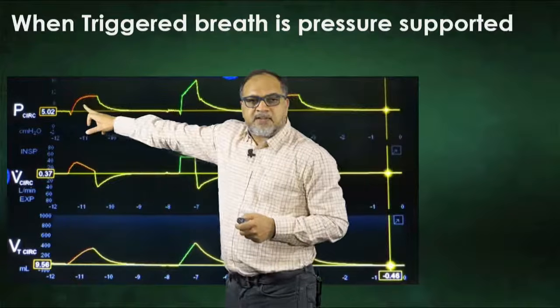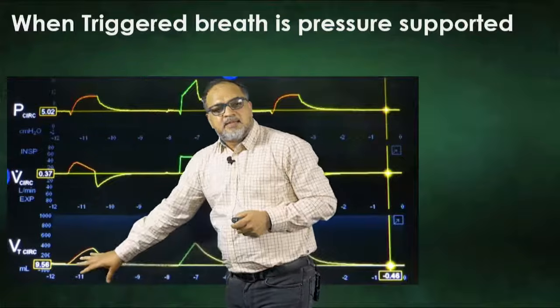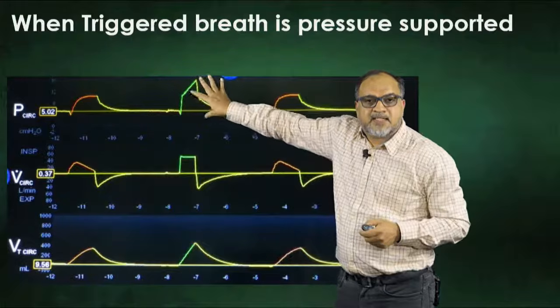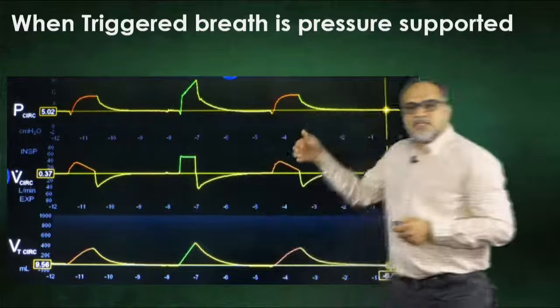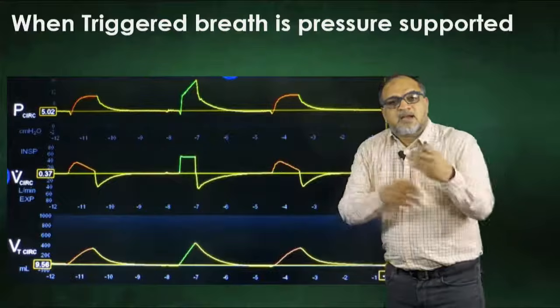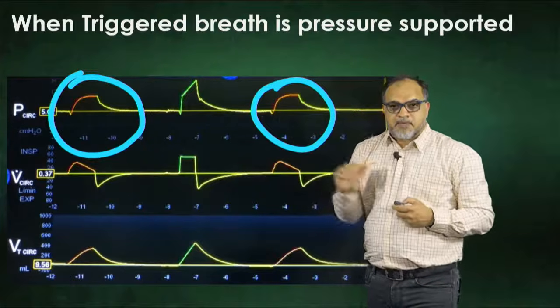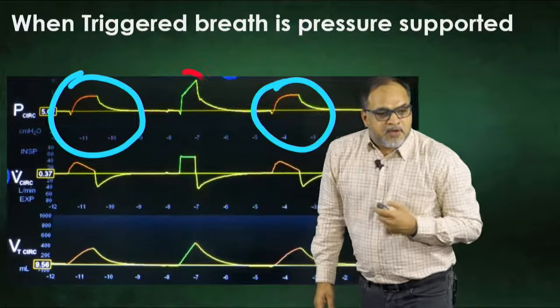This was a patient triggered breath and it was supported with pressure support, and there is a minimalistic tidal volume. This was again a patient triggered breath, but it fell exactly at the time of mandatory breaths, so it was given full tidal volume. This is again a patient triggered breath, so it was given pressure support. That is how it works. So this is SIMV plus PS. These two are patient triggered and pressure supported breaths. This one is a mandatory breath. Right.